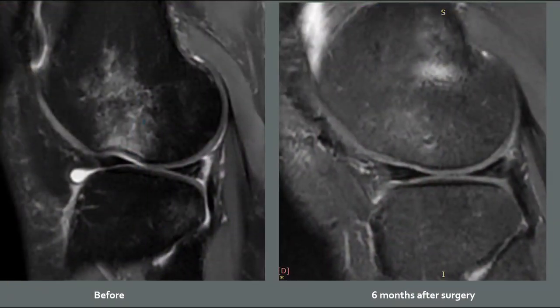The MRI follow-up at 6 months shows proper lateral compartment congruency with bone graft remodeling.